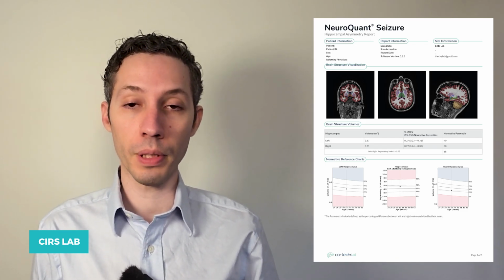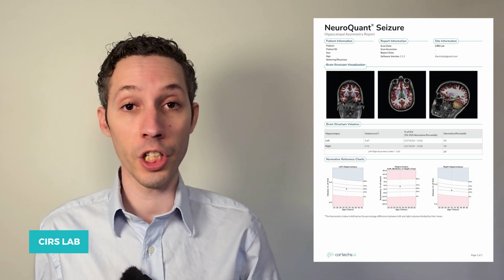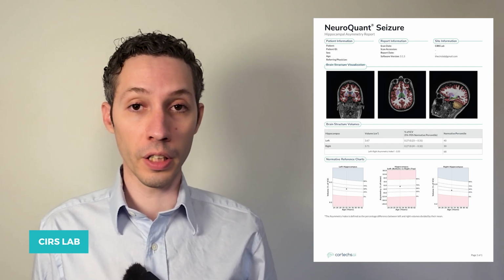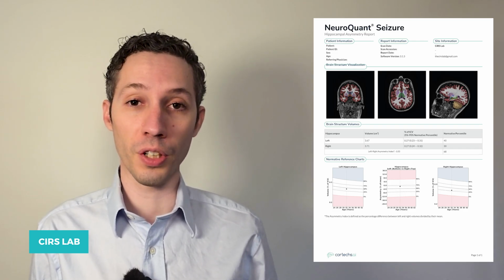The seizure report is often used for the evaluation of suspected focal or medial temporal lobe epilepsy. It focuses on quantifying hippocampal asymmetry, typically as a complementary structural assessment alongside tools such as EEG. In some cases, similar patterns of hippocampal asymmetry can also be observed in other clinical contexts, including traumatic brain injury, early Alzheimer's disease, post-traumatic stress disorder, and infections affecting limbic structures.